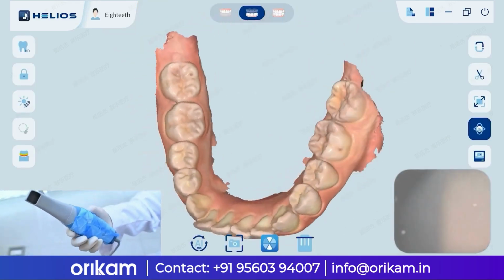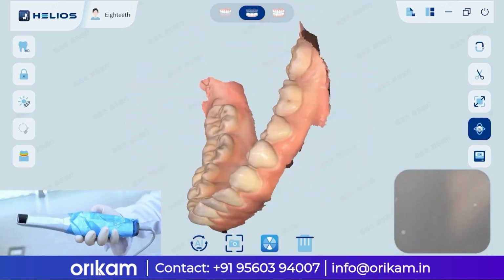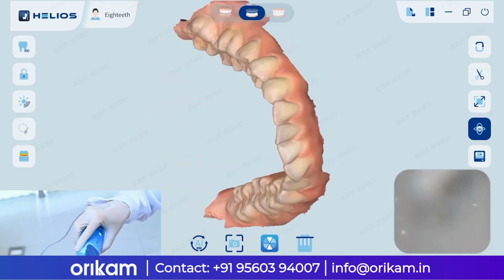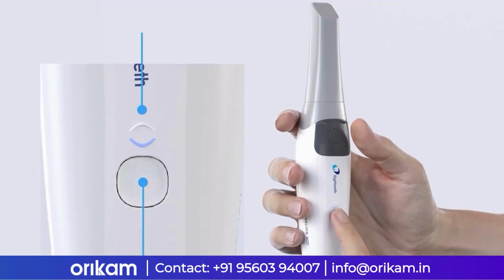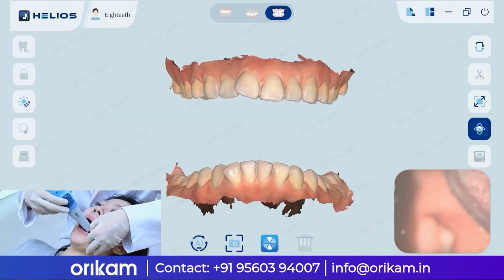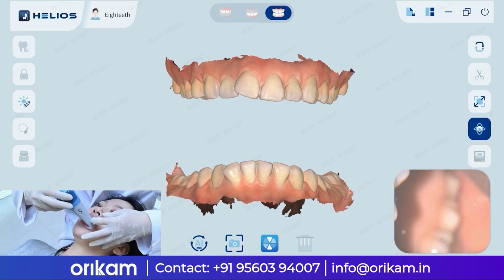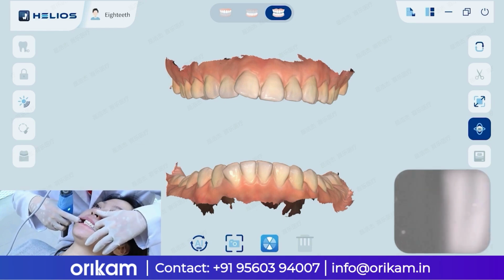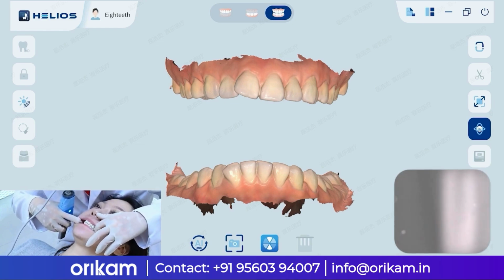Once the lower jaw scan is preliminarily completed, use the remote control function to conduct a second review. Use the buttons to switch to the occlusal mode and proceed with the occlusal scan. Before scanning the occlusion, carefully check the patient's occlusion condition.